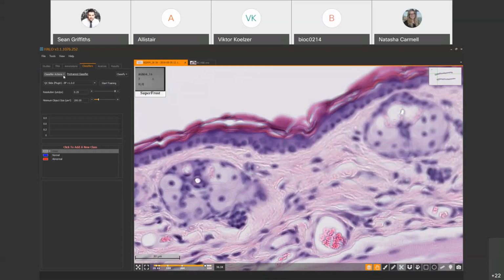And then maybe just one more thing. It might not be that flexible in terms of different versions of the deep learning models, but is it possible that I start training some model totally outside of the Halo, and then I keep the output following some format of the Halo? Do you think that would be feasible, so that the users can manipulate the output of my models inside of the Halo environment?